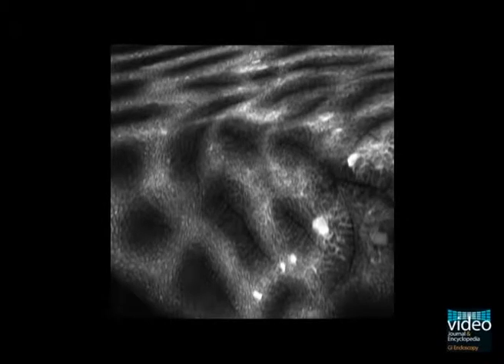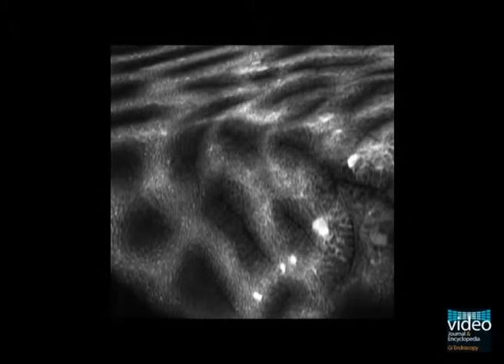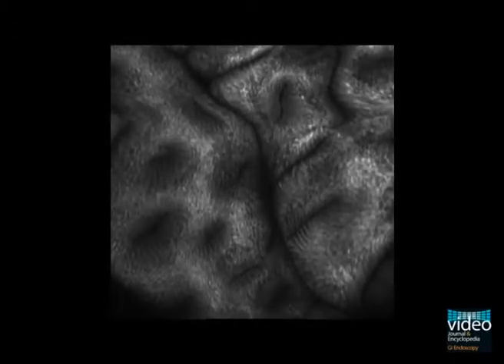Look for the honeycombing, cobblestone epithelium and small glands in the next few images of gastric mucosa. In this image, the cobblestone appearance of the epithelium is very visible. This cobblestone appearance is not found in Barrett's epithelium.